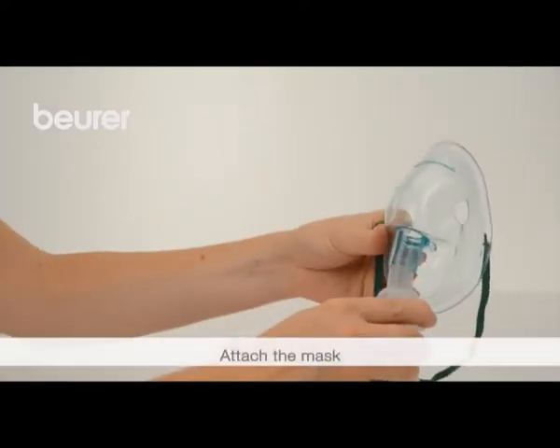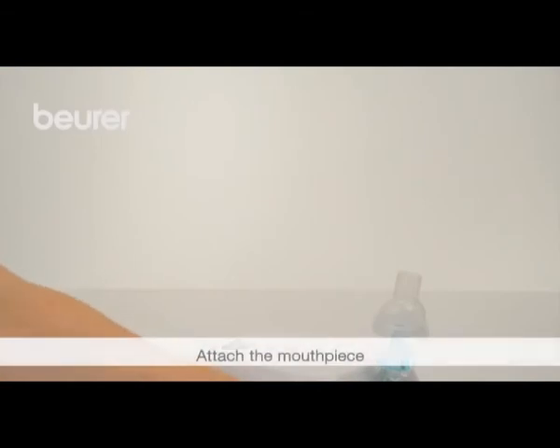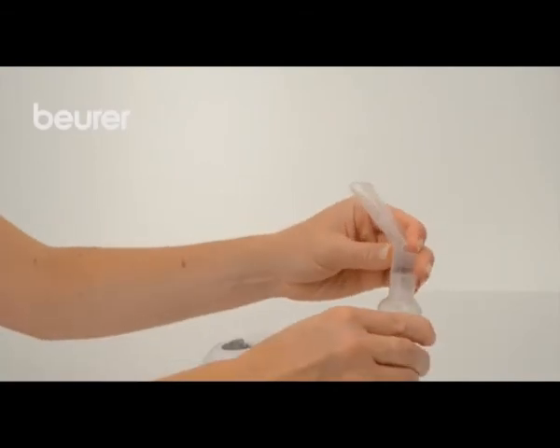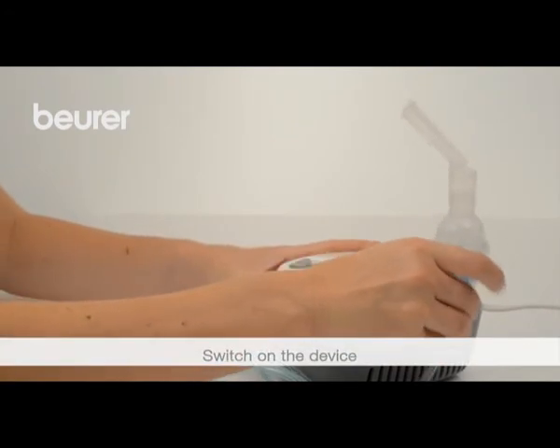Connect any required accessories such as the mask to the atomizer. Connect the mouthpiece in the same way. Take the atomizer out of the holder and switch on the device using the on-off button.